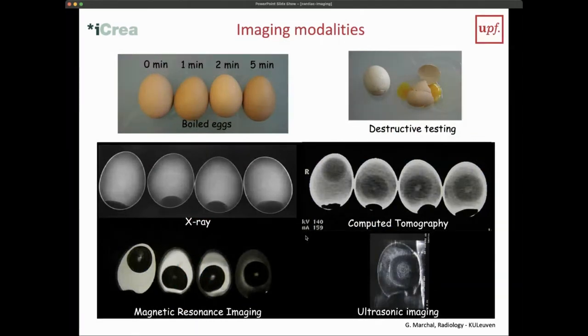And as we said before, this gives very different types of information. Regular X-ray imaging gives projection information. We don't have any depth information, but it has the best spatial resolution. It cannot discriminate soft tissues, but it can look at, for example, hard tissues and calcium, always at the best resolution that we currently have available.